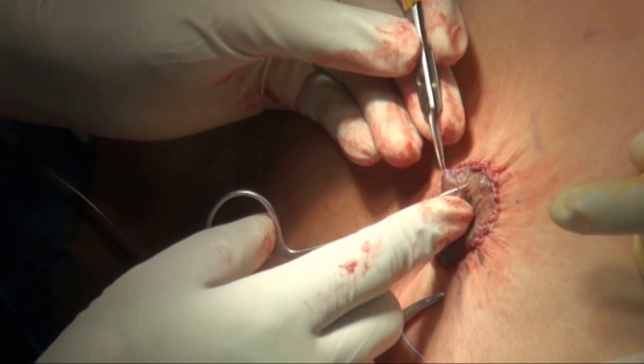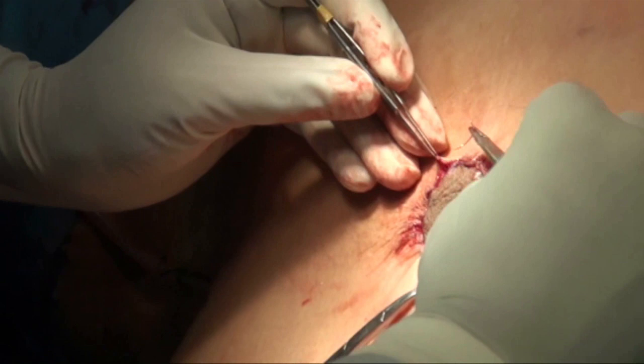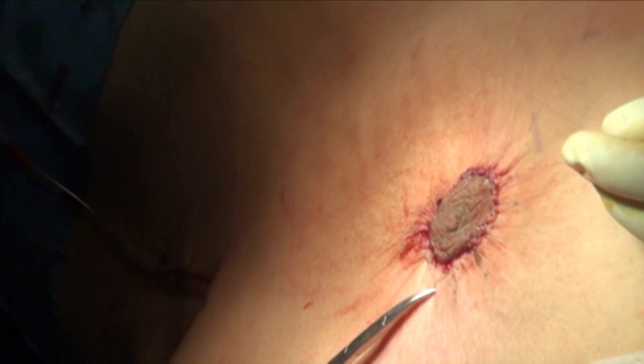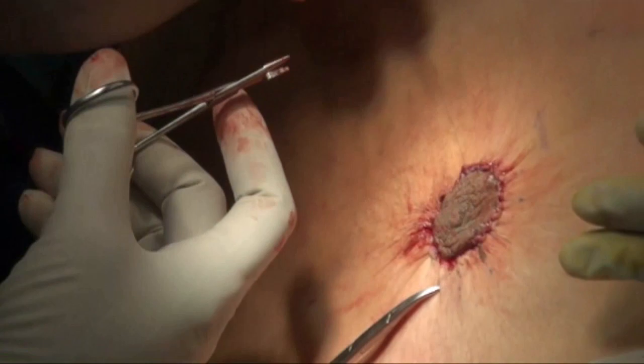A case of type 3 gynecomastia after donut de-epithelialization and periareolar purse string suture application. A larger circle of chest skin and a smaller circle of pigmented areolar skin are being joined together. Less tissue is to be included in the bite on the side of the areola, and more tissue is to be included from the skin side. The line of approximation is to be precise to have as invisible a scar as possible as a final result.